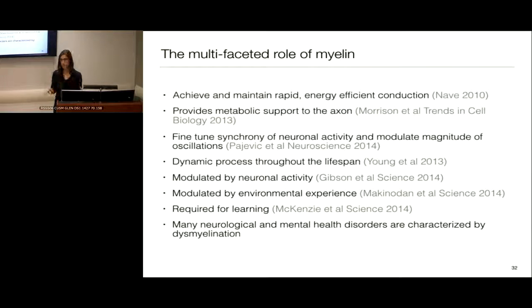We're not talking lesions anymore the way we see them in MS. We're talking about subtle hypomyelination of specific tracts in the brain, which lead to significant differences in behavior and cognition. This is what I think drove the development of my own research program, which is to continue to look at the myelin content in the brain, but for a very different objective: to look at the relationship between myelin plasticity and complex behavior or cognition.